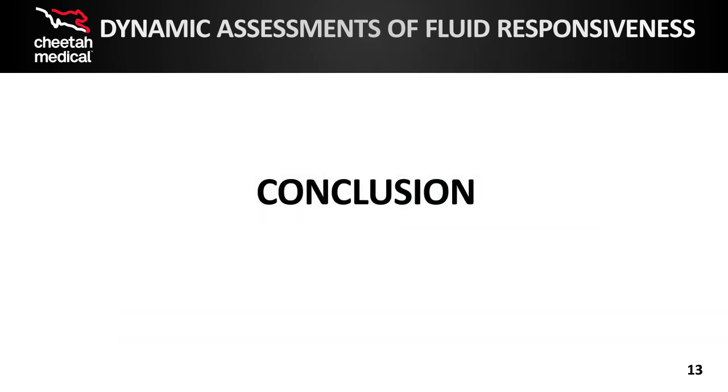This concludes the Cheetah Medical Starling SV Dynamic Assessments training. Please refer to the IFU user manual for additional user application instruction, troubleshooting, and maintenance information.